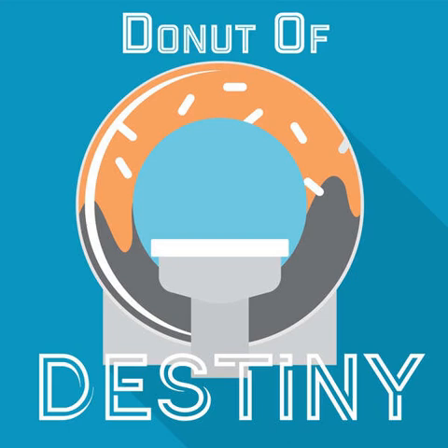As we know, compared to CCTA alone, the addition of CT-MPI improves the diagnostic accuracy for the functional assessment of coronary artery disease. The reported sensitivity and specificity yields between 82 to 92 and 73 to 86% respectively. Can it contribute in patients with untreated CAD and in revascularization patients too?